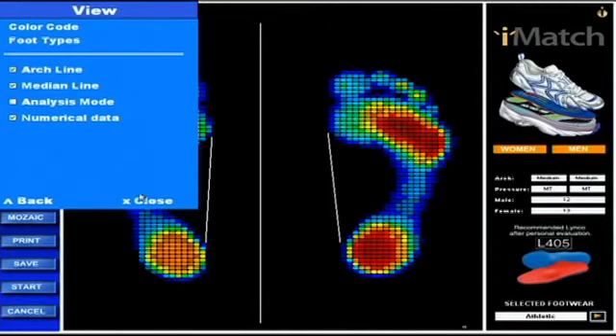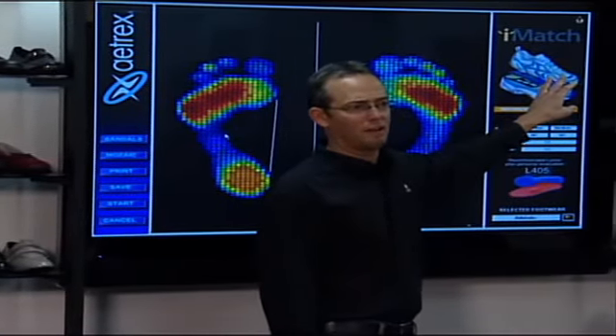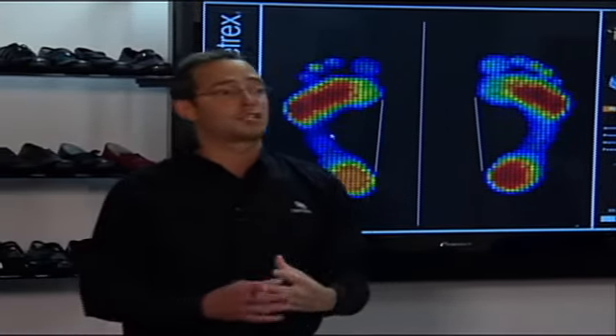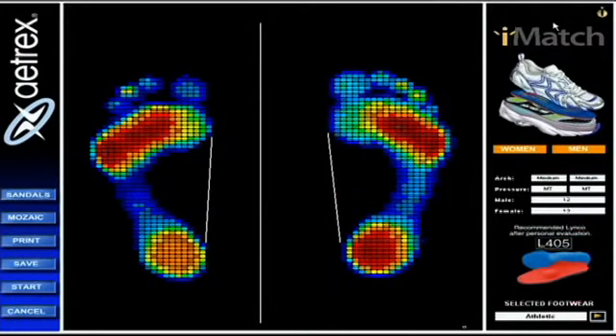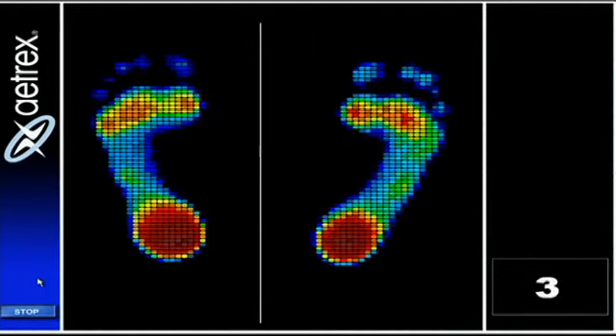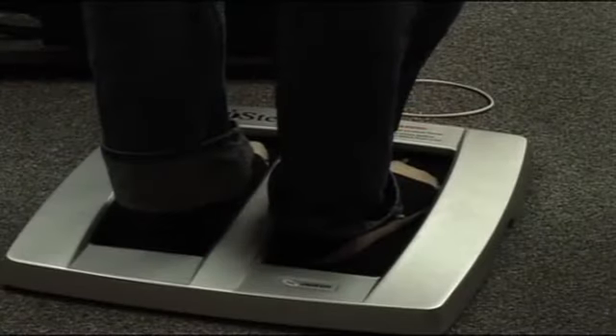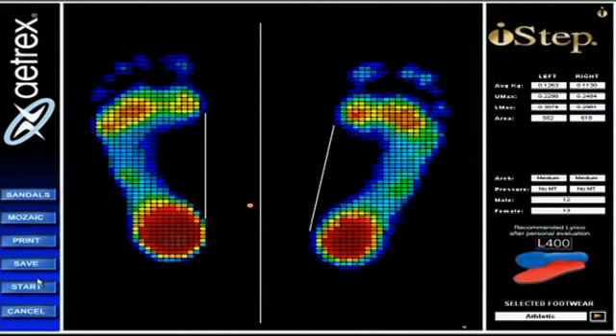Now in this section on the i-Step screen there are three different options. One is iMatch — as you'll see later, iMatch is an area where you can click a button and have products that match up to your feet. I'll show you the other two options first. Also note: my pants are rolled up for this test because the infrared technology is so sensitive that if pants are low, it will pick up the pants and think that's part of your feet. So you need to roll them up a little for a more accurate test.